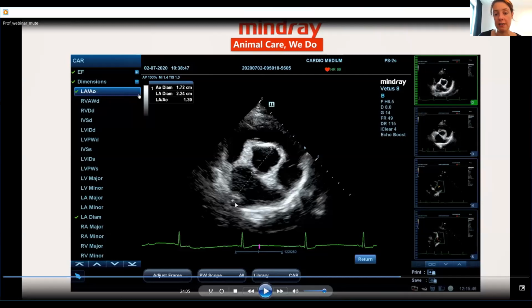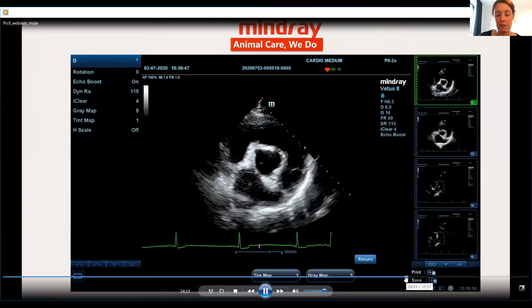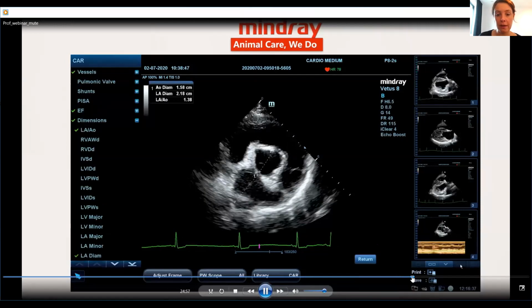There's a lot of debate on this. You see here it's not clearly delineated. You should probably not measure all the way up here. You should also probably not measure all the way up here. It's probably around this. It's not a problem for this dog because this dog is obviously completely normal, and I have an LA/AO of 1.3. So this is not an easy measurement. And for this reason, we will also measure the left atrium from some different views. Here I'm explaining again that the delineation here is not perfect.